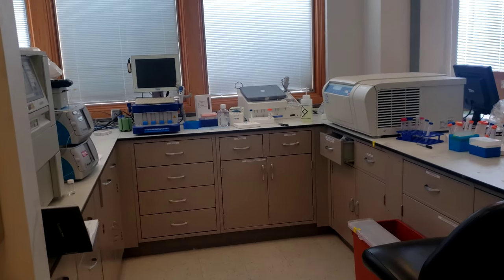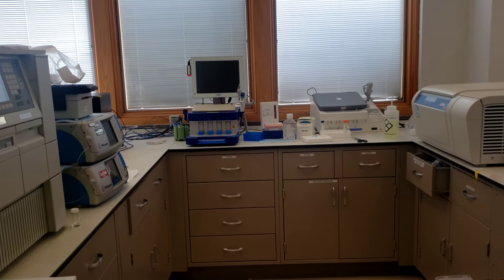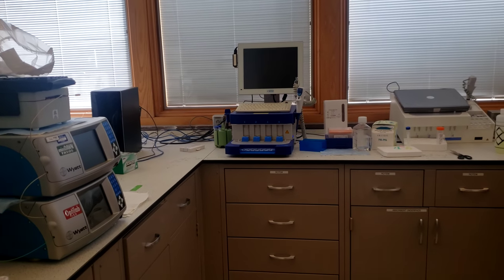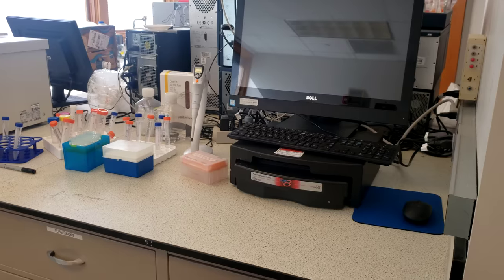Over here we have two of the instruments that we use to measure how our materials interact with blood: specifically a ROTEM, or rotational thromboelastometry, that measures the physical characteristics of blood as it clots, as well as a platelet aggregometer.